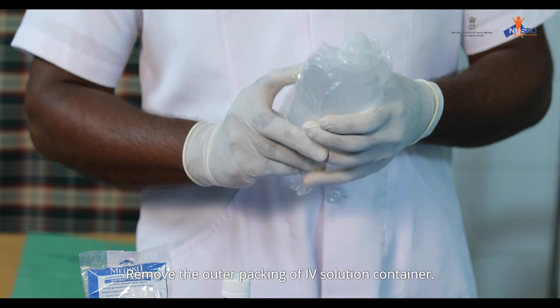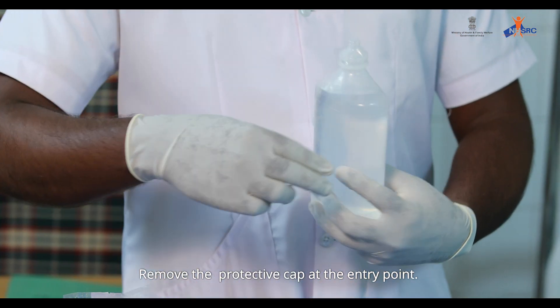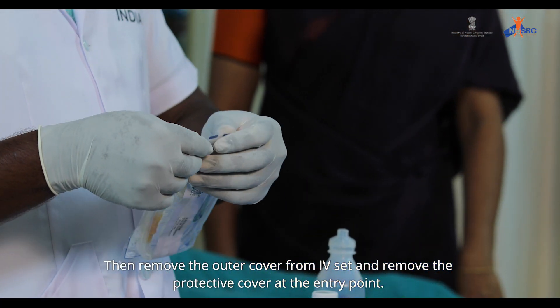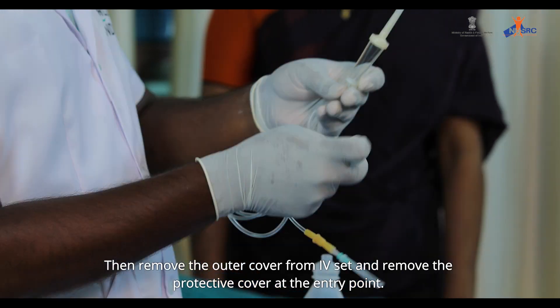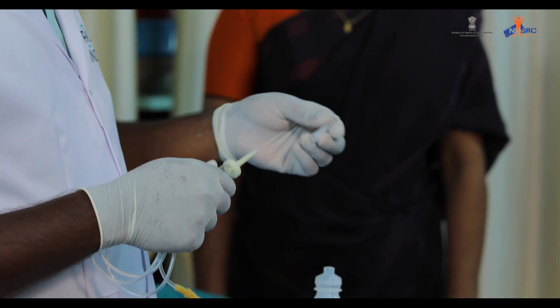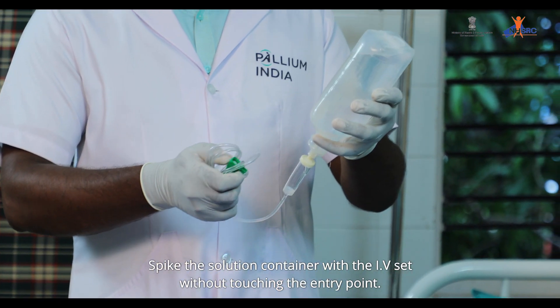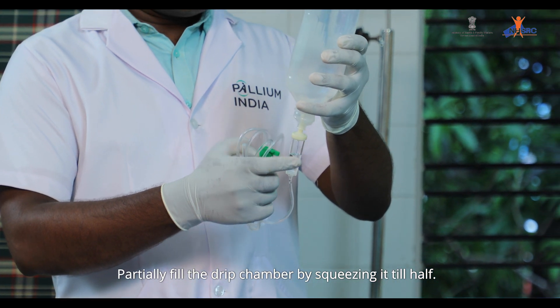Remove the outer backing of the IV solution container. Remove the protective cap at the entry point. Then remove the outer cover from the IV set and remove the protective cover at the entry point. Spike the solution container with the IV set without touching the entry point.